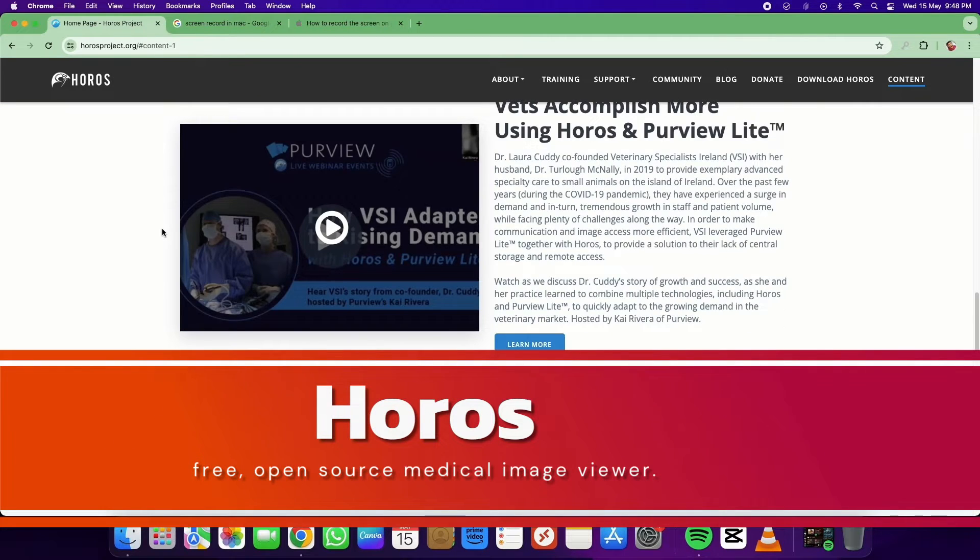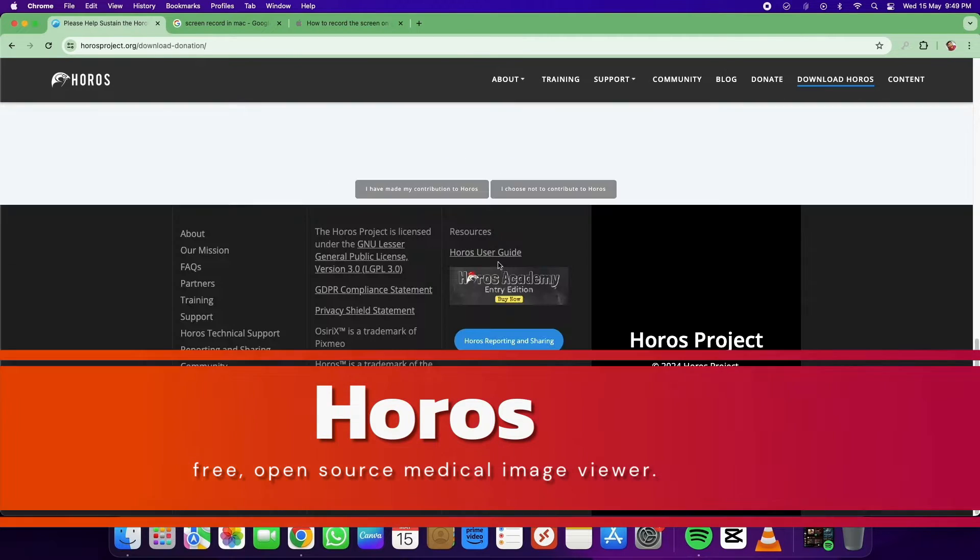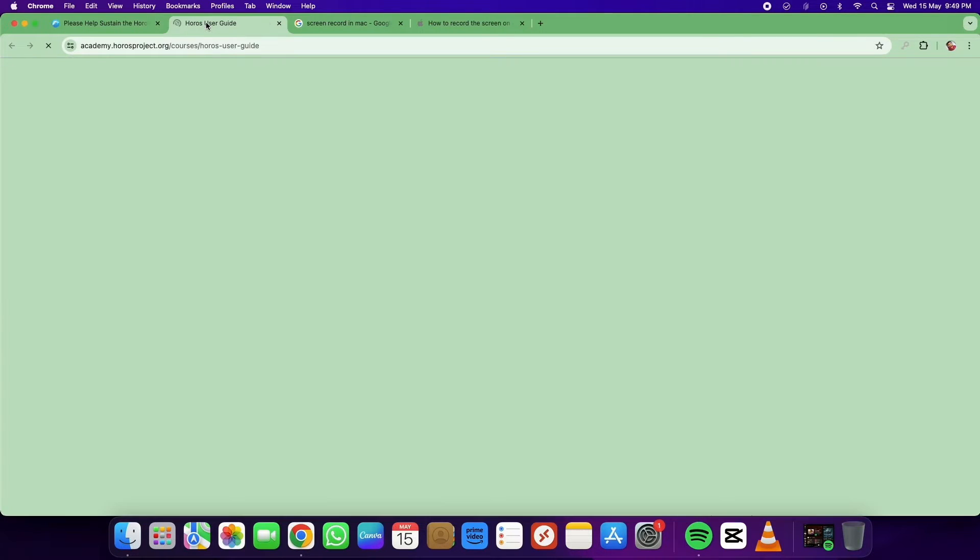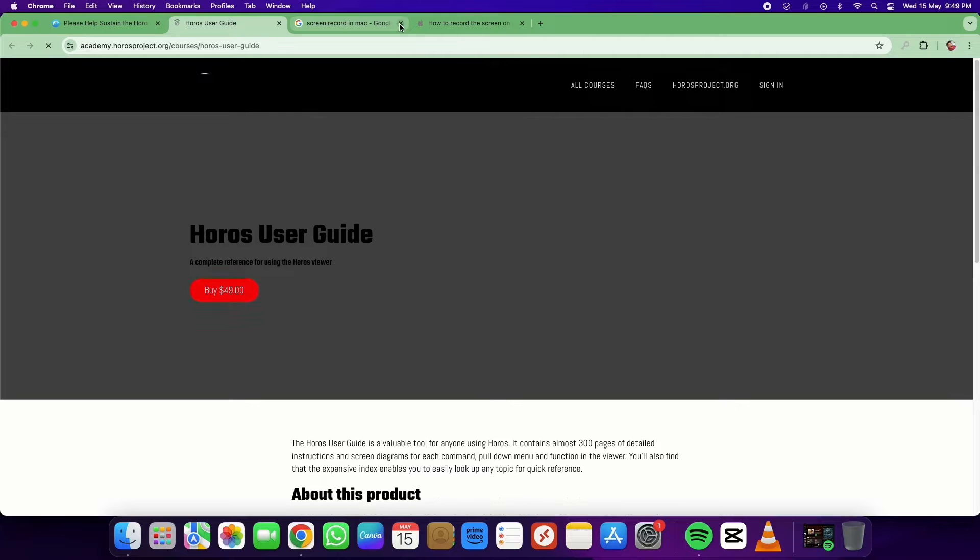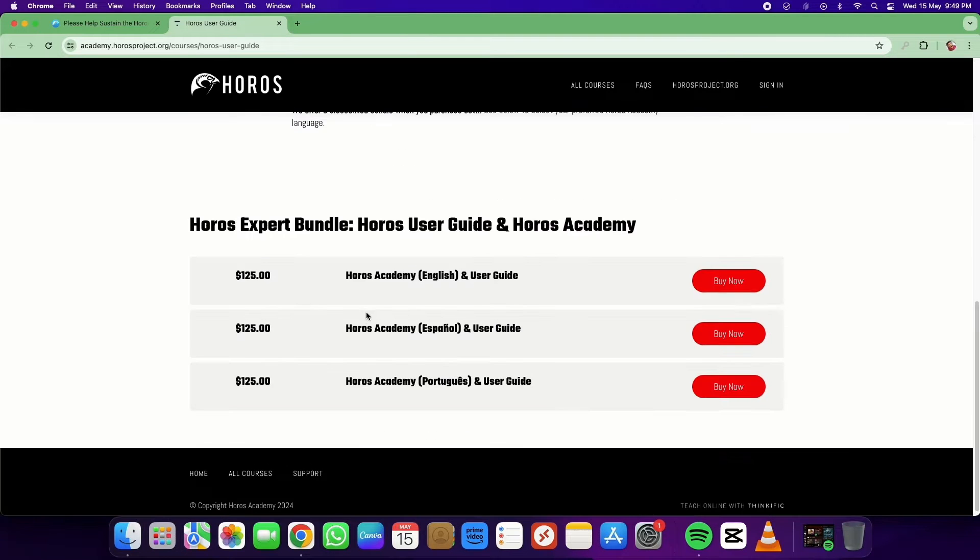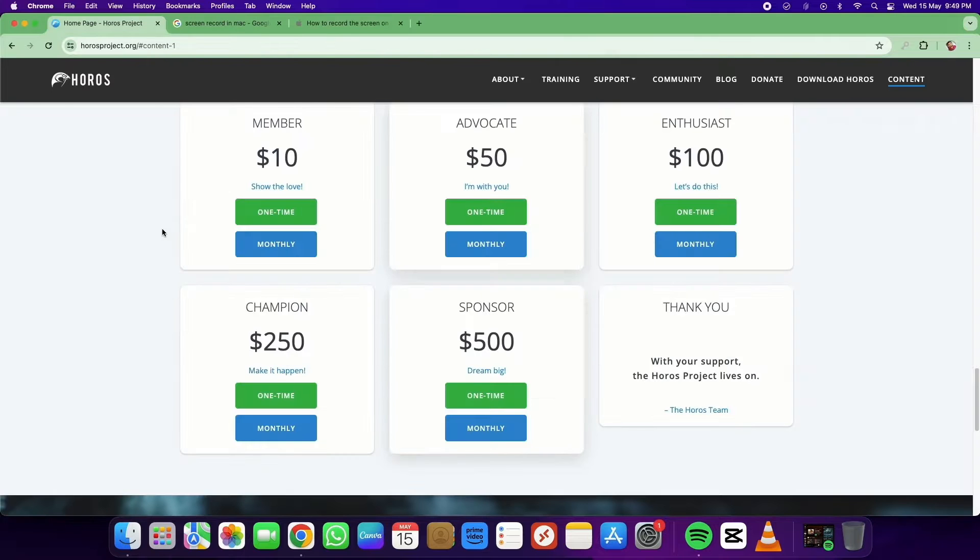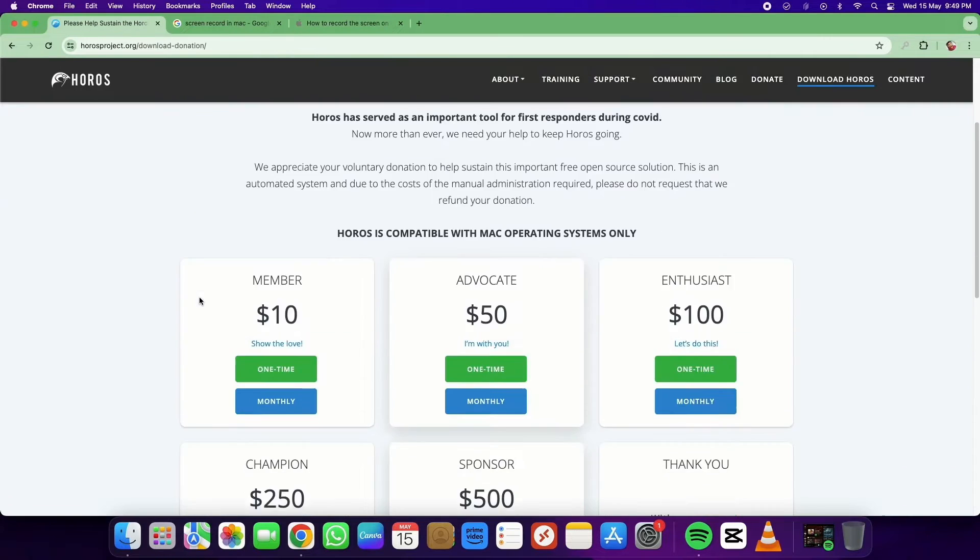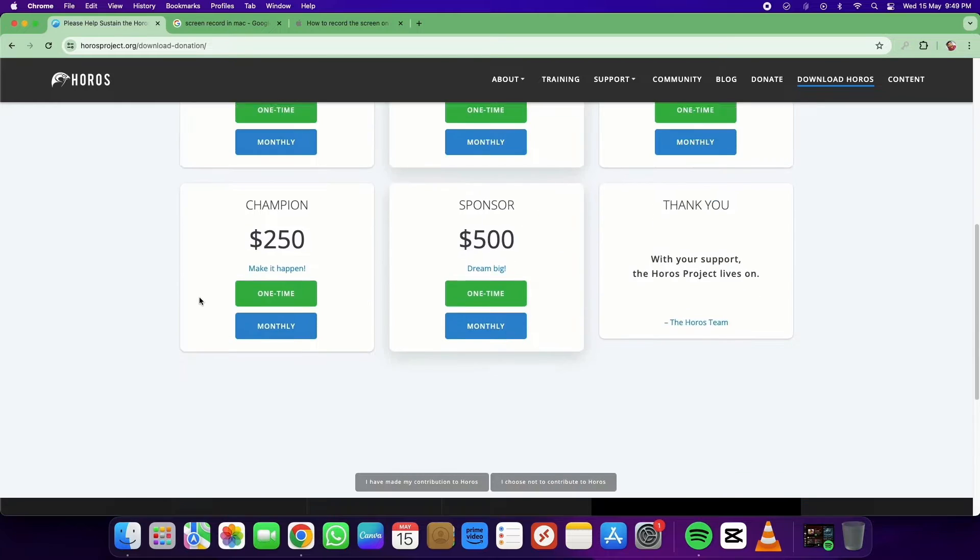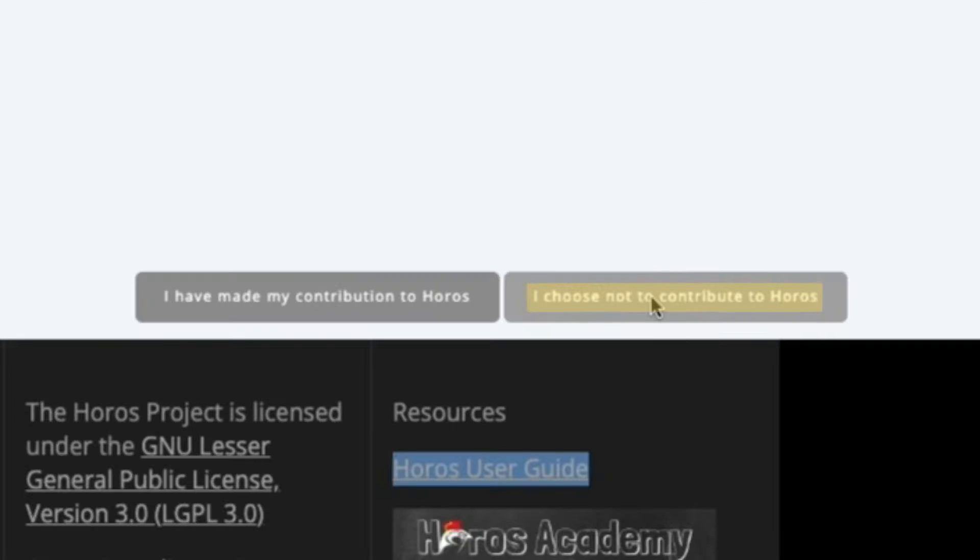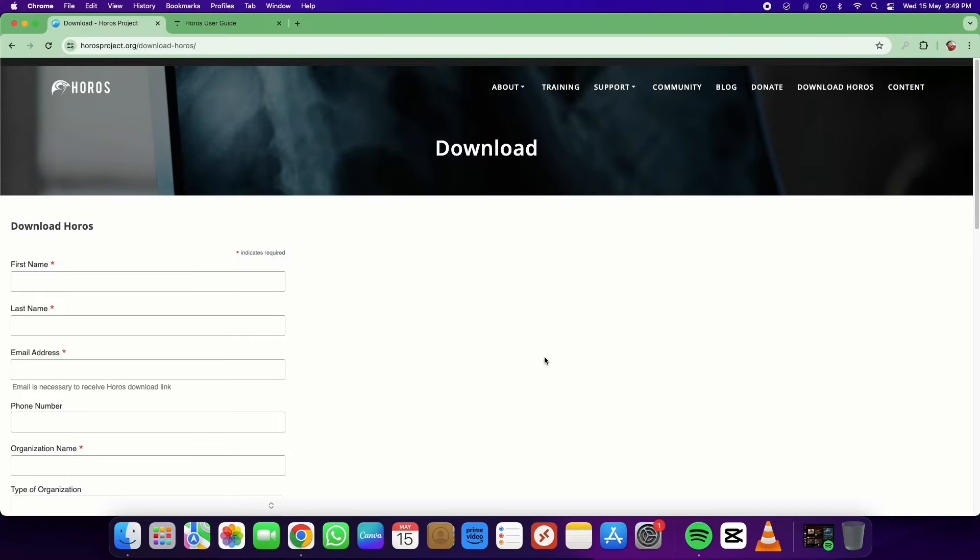Unfortunately, the software is free but the user guide is paid. To continue this free project, we need to make some contributions. For this demo, I am skipping the contribution page and going directly to the download.